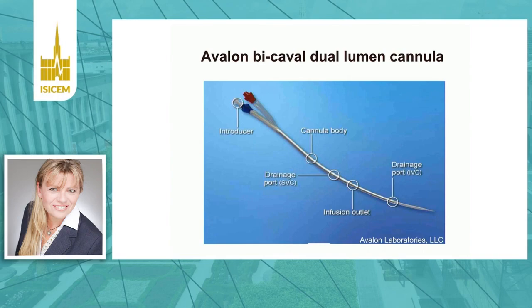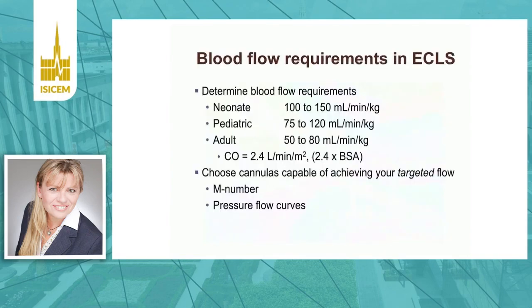There are some blood flow requirements in ECLS, and it's really important to determine them depending on the age and weight of the patient. It's also important to know, for example, the pressure flow curves and pressure drop compared to the diameter of the cannula.